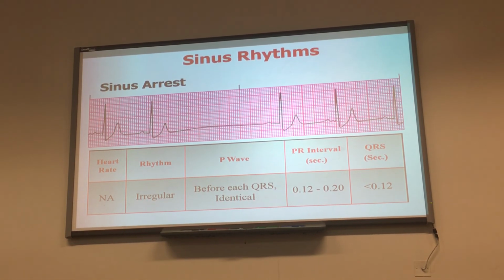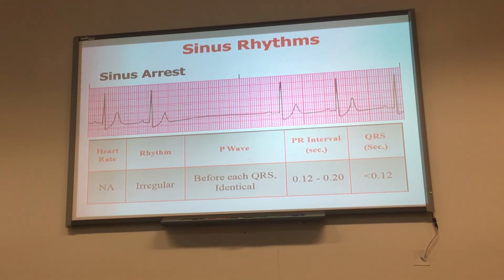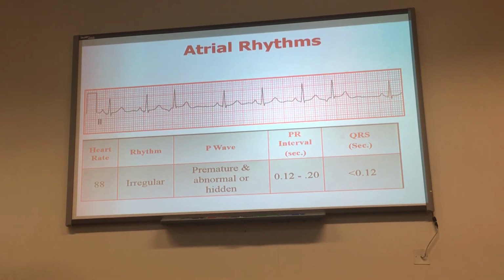Is there ST depression or is it wrong? There is, but again, it's only one lead, so we cannot tell about ischemia or infarction or whatever from one lead. Minimum of 2 leads.